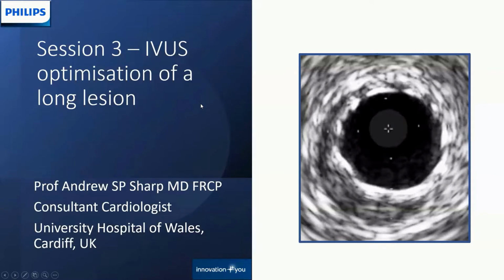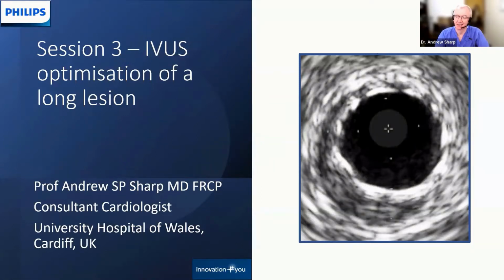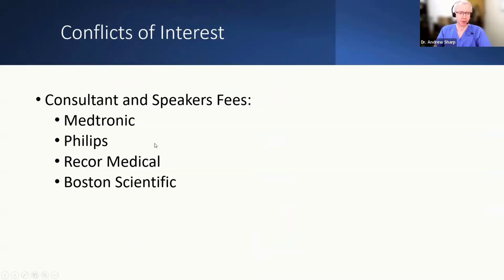So I'm going to share my screen now. Okay, great. And I'm grateful to my colleague, Dr. Sean Gallagher, who you'll see in a minute, who's our director of cardiology. He does about 600 PCIs a year himself, which is the size of a moderate sized hospital, the volume that he does. And we did it together. And I'm very grateful to the patient and to the staff who allowed us to record this.